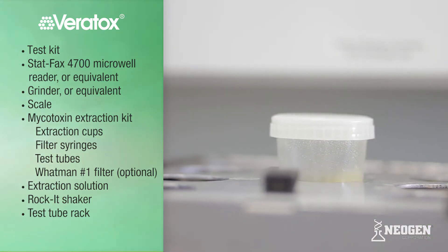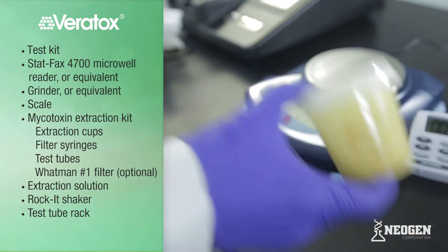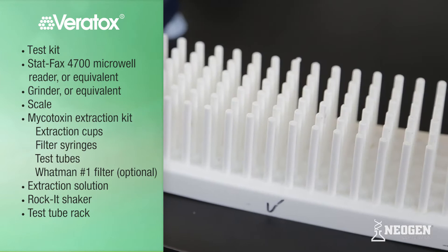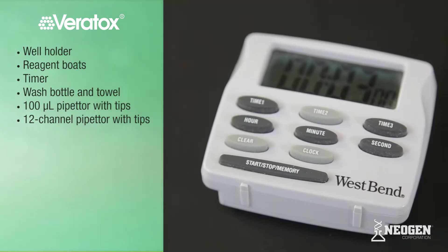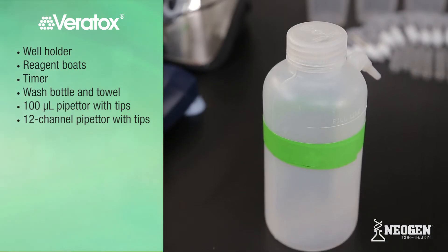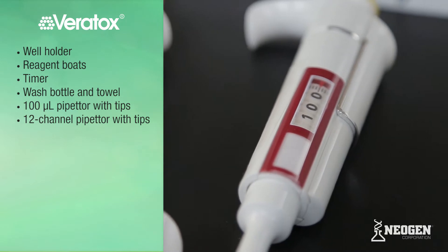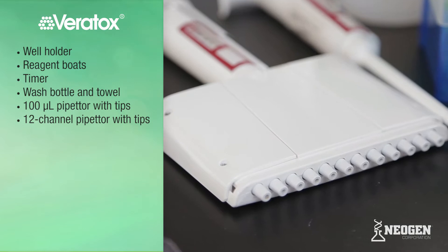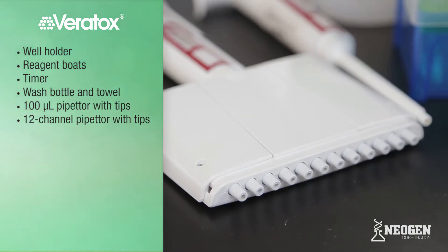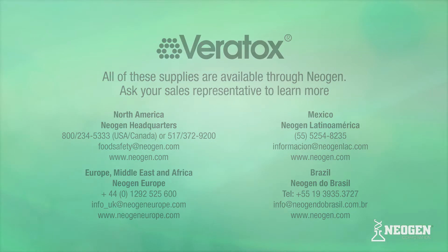A Rock-It shaker or equivalent, if you are extracting multiple samples at once or wish to use a mechanical shaker rather than shake by hand. Test tube rack, well holder, and reagent boats. A timer. Wash bottle. Towel or absorbent surface. A 100-microliter pipetter with tips, and a 12-channel pipetter capable of dispensing 100 microliters with tips. To order any of these supplies, please contact your Neogen sales representative or our customer service department.